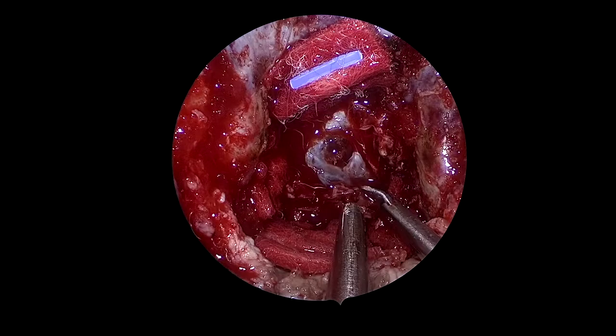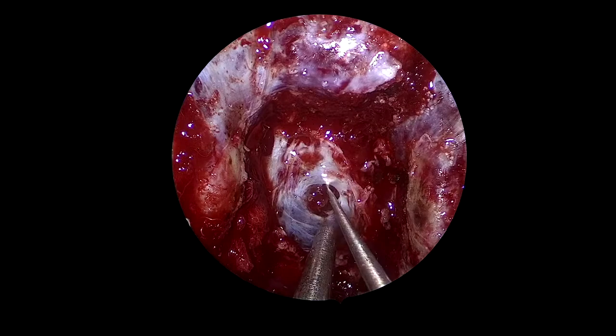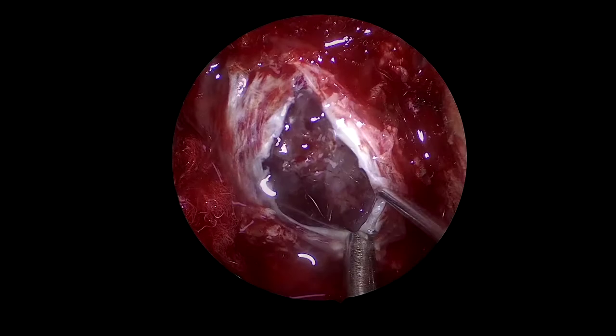Now that all the extradural tumor is gone, even with margins, we're going to the intradural portion of the operation. We can see the small dural penetration that the tumor created, and we have to greatly expand this to perform a safe tumor resection.